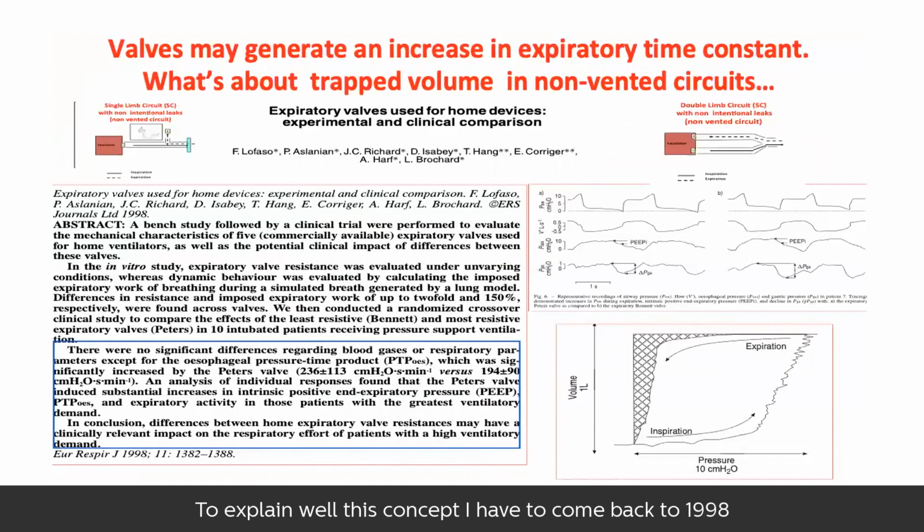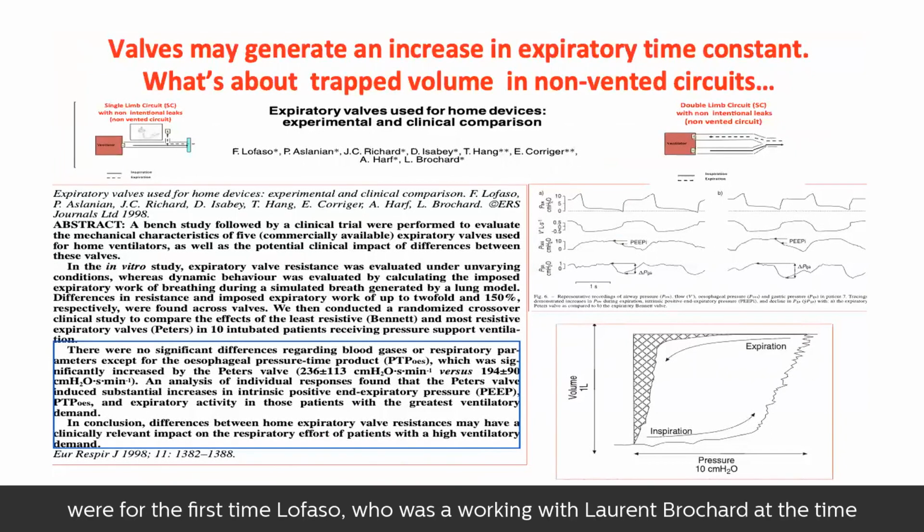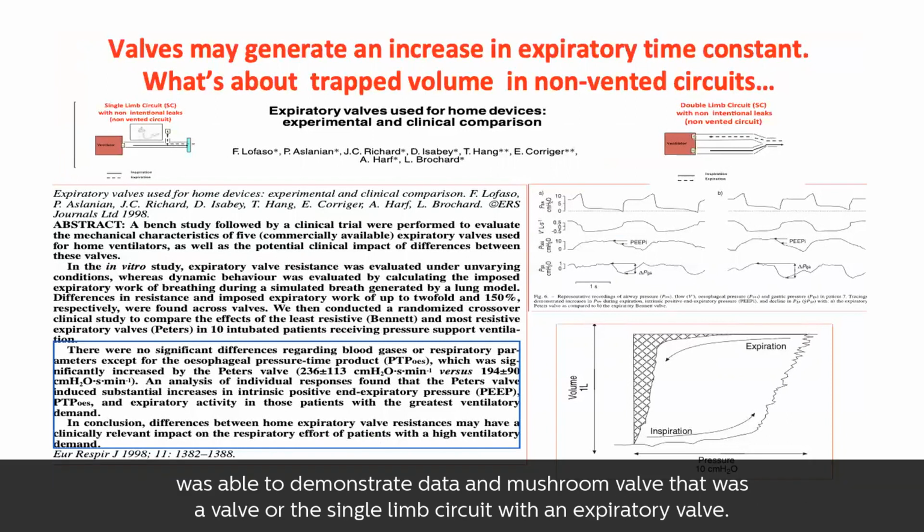To explain this concept well, I have to come back to 1998, when for the first time Lofaso, who was working with Laurent Brochard at the time, was able to demonstrate that a mushroom valve, a valve of the single limb circuits with an expiratory valve.